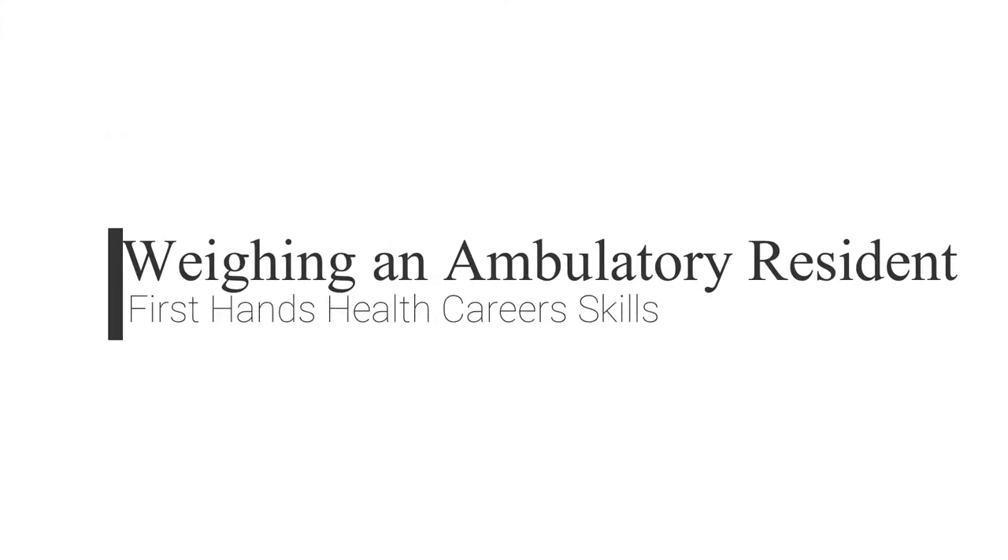Hi, I'm Fern, one of the instructors with First Hands Health Careers and today we are going to demonstrate weighing an ambulatory resident. Today we have Rick Bailey, who is going to be playing the role of our resident.